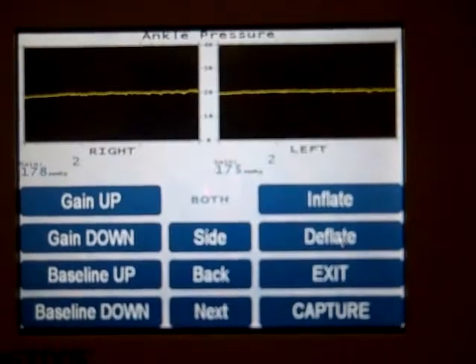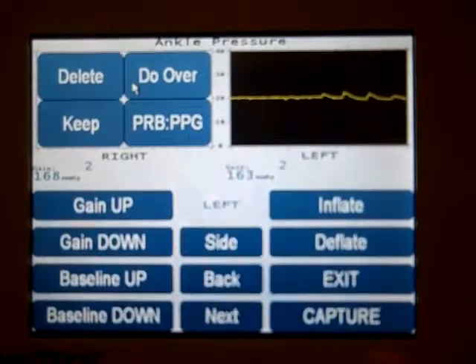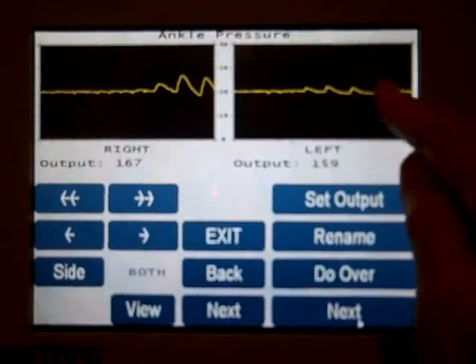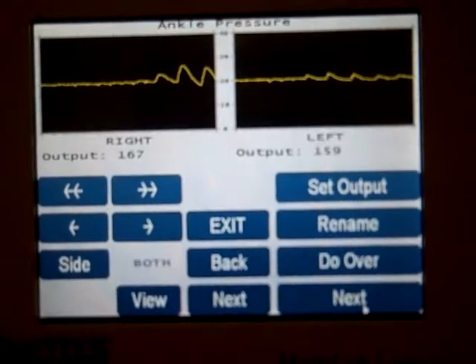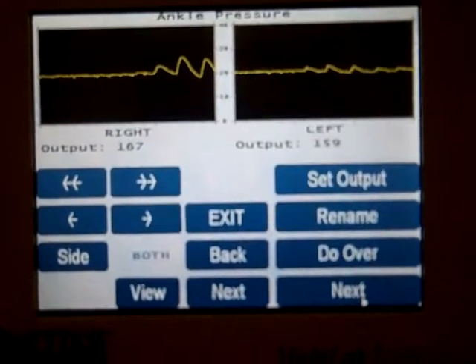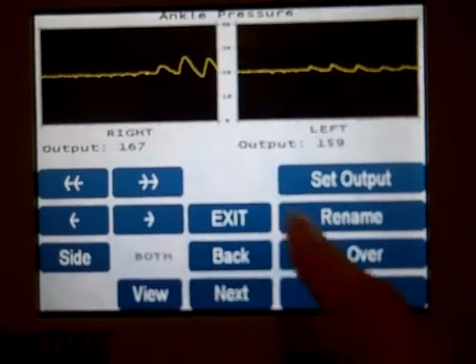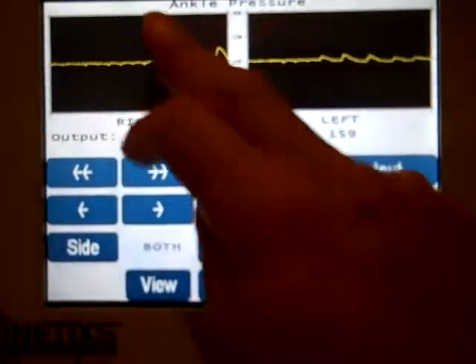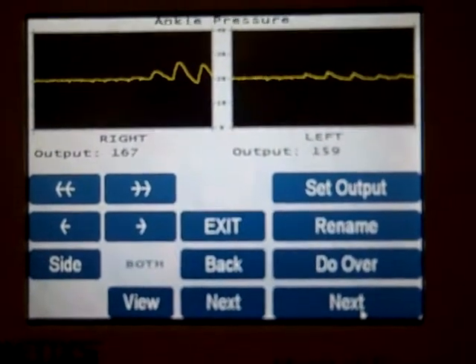Now what you want to do is capture the first reappearance of pulse — there's that one — and press capture when you see it. What will sometimes happen is after the first reappearance of the pulse, it may go back to flat line. So as soon as you see the first three or four pulses, touch the waveform box to freeze it while you wait for the other side to come in.